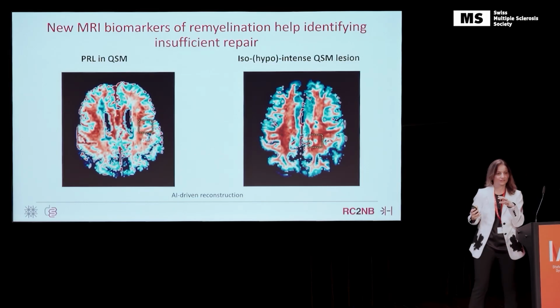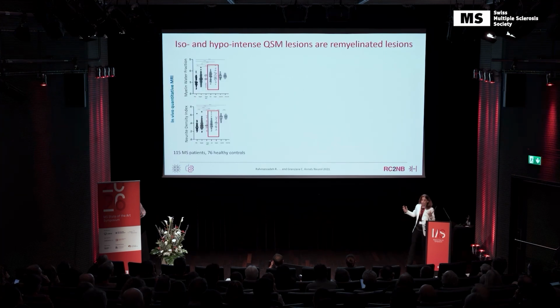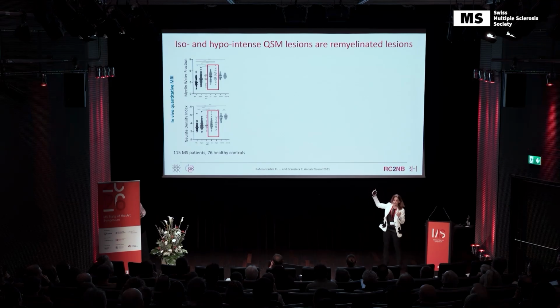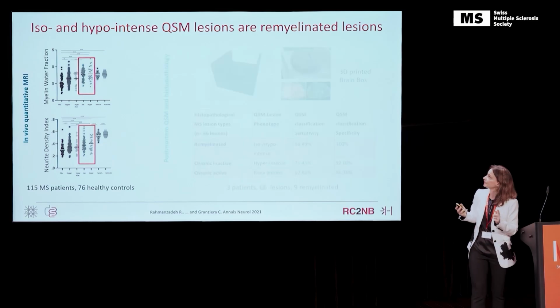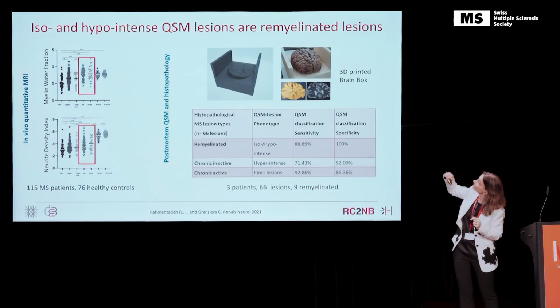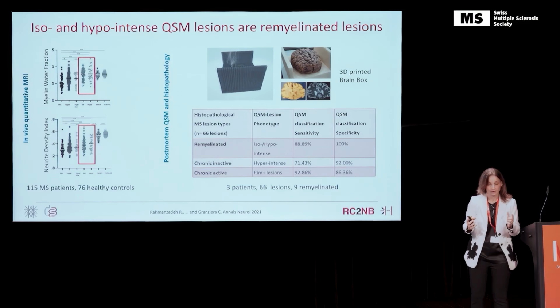It's the same for lesions that are a bit blackish, which we call hypointense. So these iso-hypointense lesions behave like this. And we quantify it. So these are the lesions in the two boxes, again with these measures, myelin-related and axon-related. And you see that these lesions, compared to all other lesions, have higher content of myelin and higher content of axons, which let us hypothesize that those are remyelinated lesions.